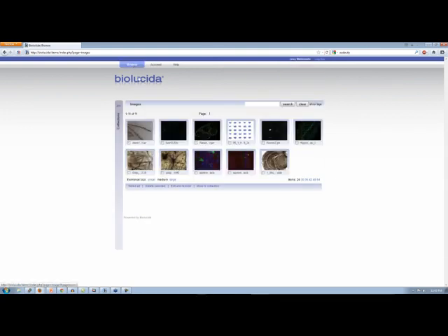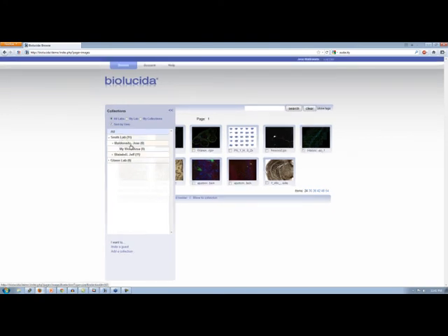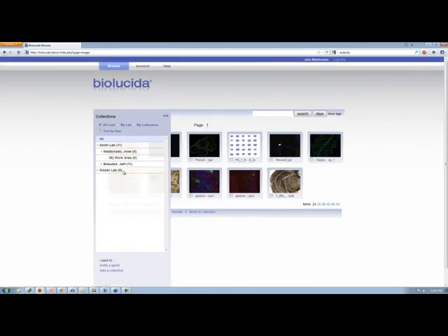We're going to go to the Browse tag. And as you can see, those are the images we shared. If you click on the collections and look at the list, let me zoom in on this. The only collection that you see listed under my name here is that single project, 6.7, that we just added. I have a number of other collections. You don't see them. You don't even know they exist. And previously I had access to none of these collections, so now I can see just the one that you let me see, right? Exactly.